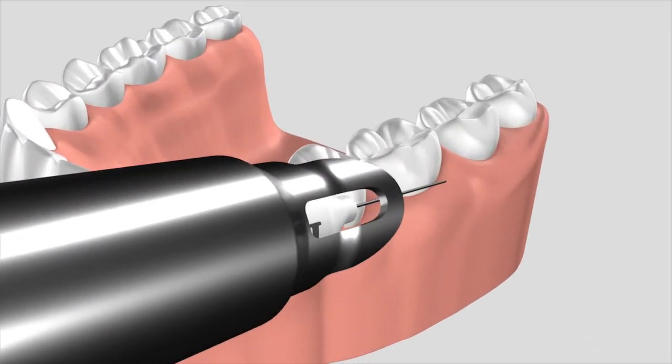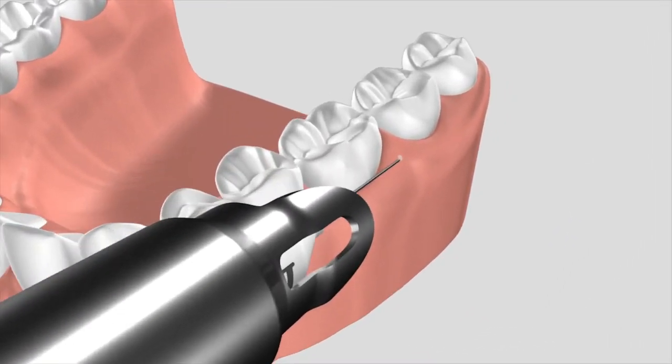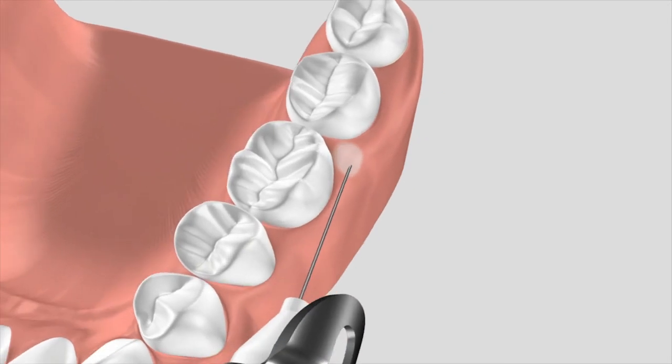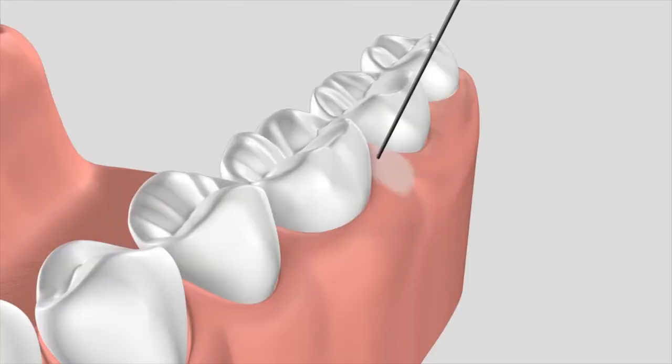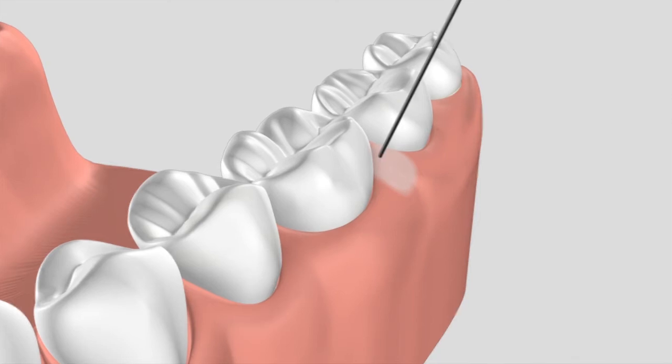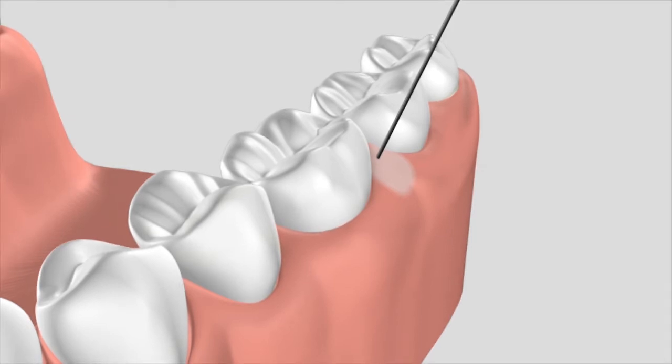Place the bevel on the tissues and advance it very superficially, while at the same time starting the drop-by-drop flow of anesthetic with the grey foot pedal. Once you have obtained the residual blanching, release the injection pedal, remove the handpiece, reposition yourself and prepare for step 2. Make contact with the bone at the very top of the interdental papilla and adjust the angulation so as to be aiming towards the center of the cancellous bone in between the two teeth.